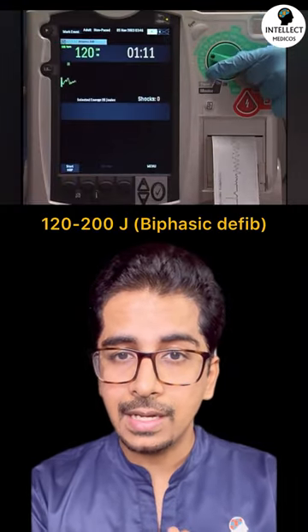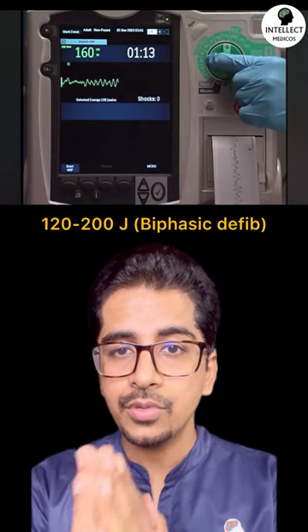After that, you have to select the energy. It is recommended to use a biphasic defibrillator set to 120 to 200 joules.